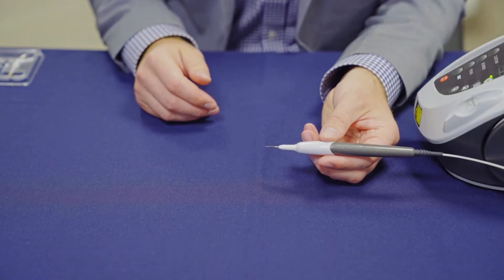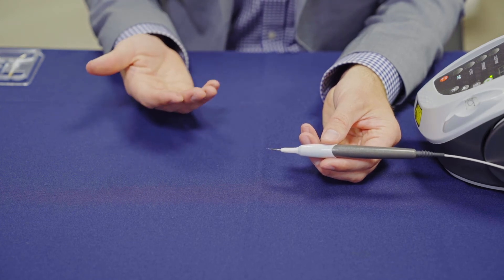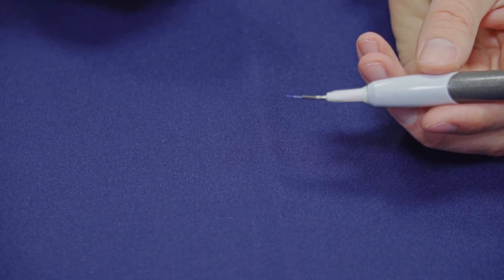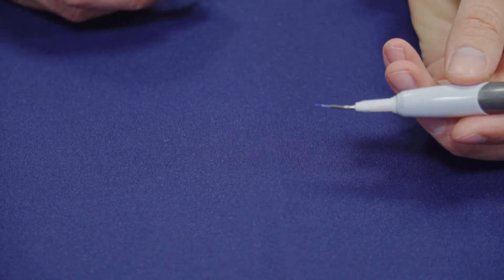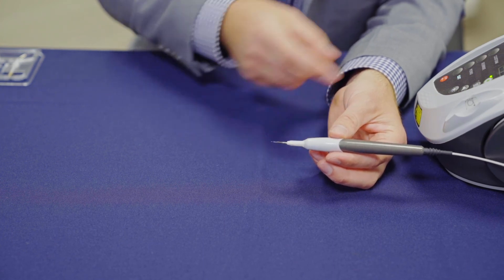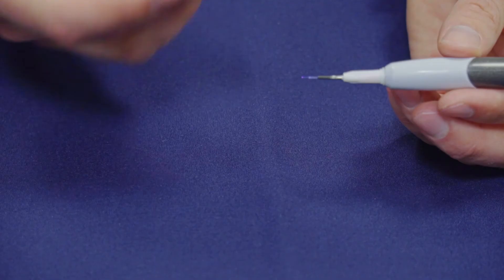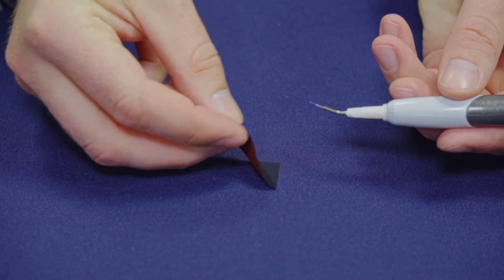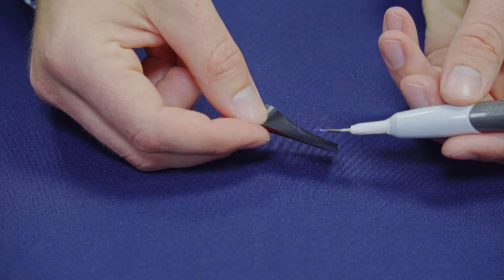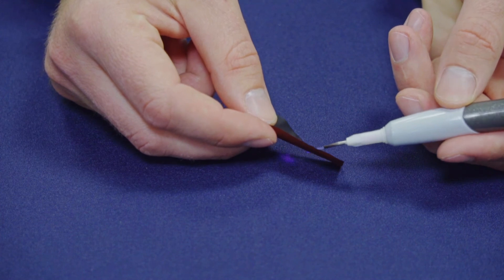Once your Sole desktop unit is set up and ready to be used, you may find that for certain procedures it recommends using an initiated laser tip. To initiate the laser tip, take your laser tip and make sure it's fully on the unit. Make sure your unit is on and in the green ready mode. Take some simple articulating paper from your office or that was shipped with the unit, press the laser tip to the paper, and activate with the foot pedal.